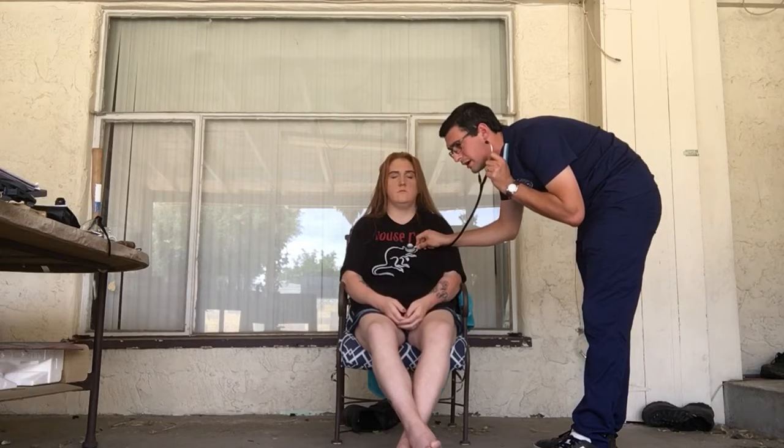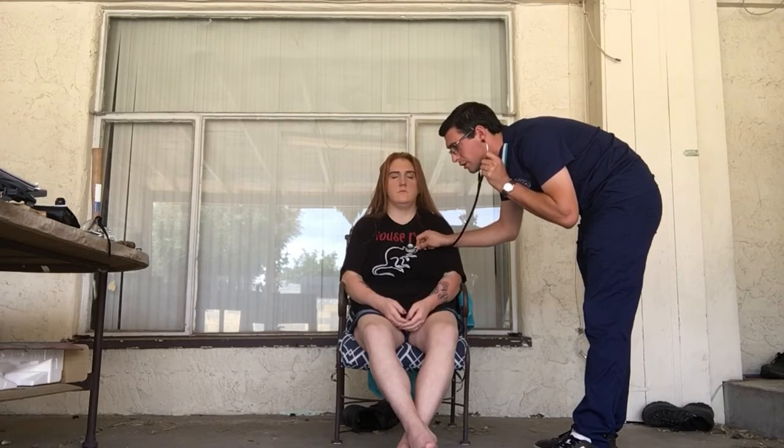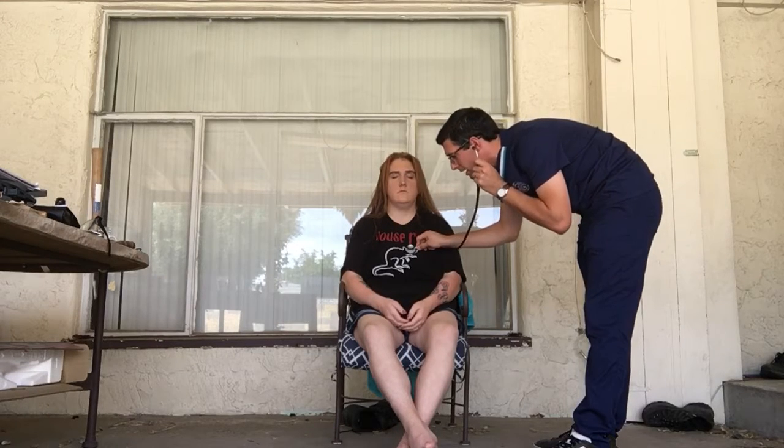Tricuspid, S1 louder than S2, left sternal border, fourth intercostal space. And move on to mitral, fifth intercostal space, left midclavicular line. S1 louder than S2. Can I have you lean forward? It's the apical pulse. I would listen for 1 full minute. Rate is 80 beats per minute.